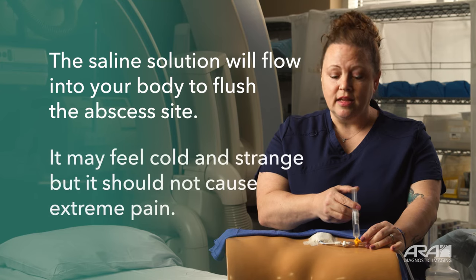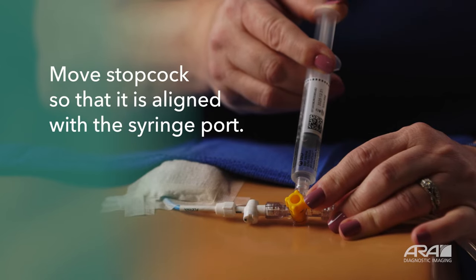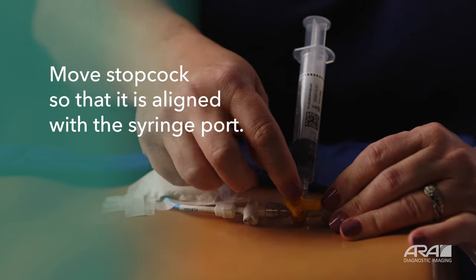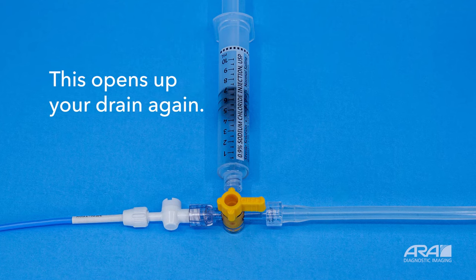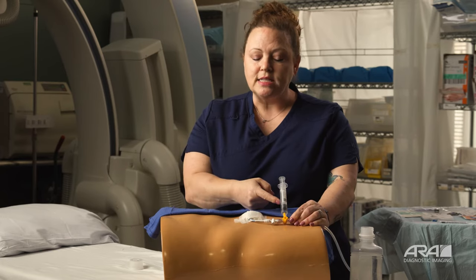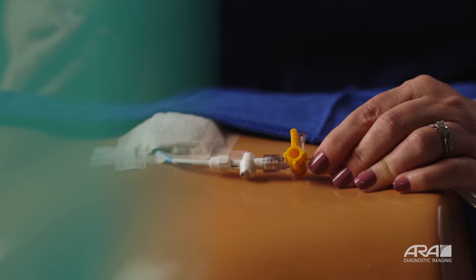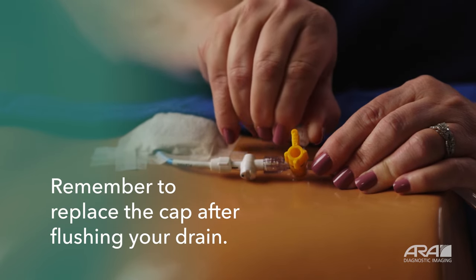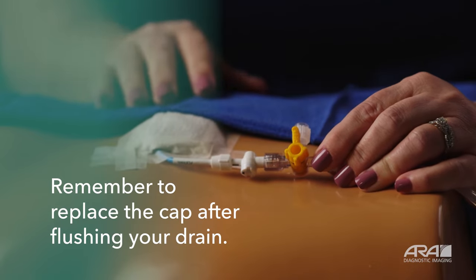When you're ready, slowly push the saline solution into your drain. You may notice a cold feeling — it may feel a little strange, but it should not create severe pain. Once you've finished flushing, turn your stopcock so that the off limb is pointed toward your flush; this opens up the drainage from your drain into your catheter tubing. Once your stopcock is facing your syringe, you may slowly turn and disconnect your syringe. Once you've removed your flush, take your cap, insert it back into your port, and tighten it just slightly. Do not over-tighten the cap, as this will make it very difficult to remove next time you're ready to flush.